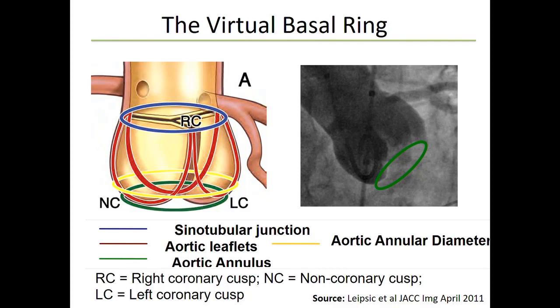And that helped us a lot, because when I look back to the early days, when I arrived at St. Paul's in 2008, John Webb used 2D echo. Before that, he gave a woman a small valve and a man a big valve. So this was a real leap forward. But it is probably, and almost undoubtedly, an oversimplification of the very drivers of procedural success.